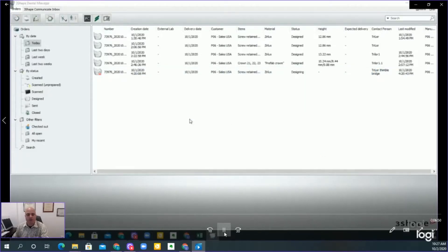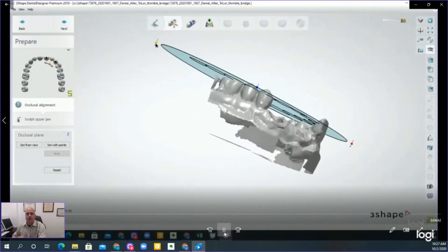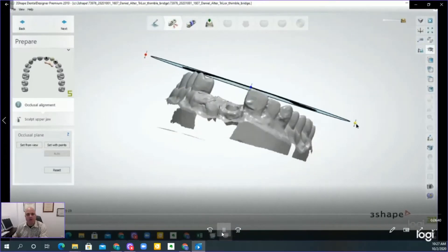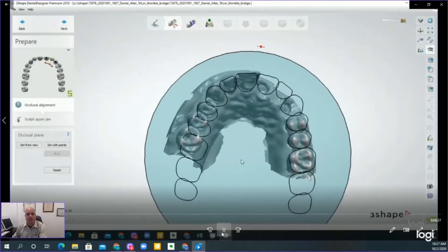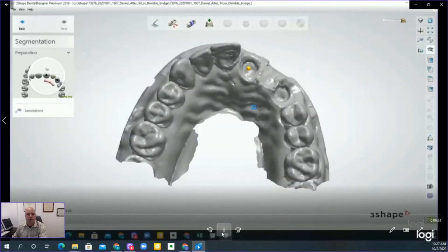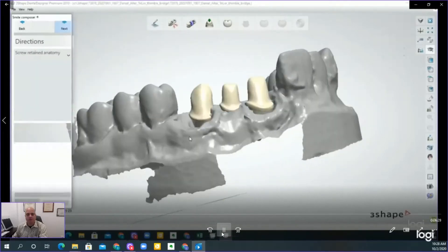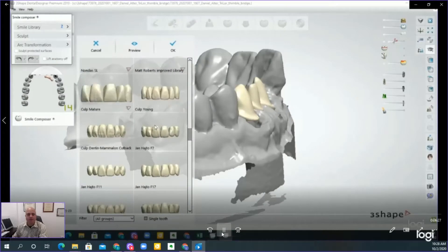Once you import it in, you can go ahead and access the scan, as we see here, and it'll go right into design. The design follows the typical manner: we first go ahead and align, as we've done with every case so far. This is the 2019 workflow in Three Shape. Once we align, we can establish exactly where the placement of the implant sites is.